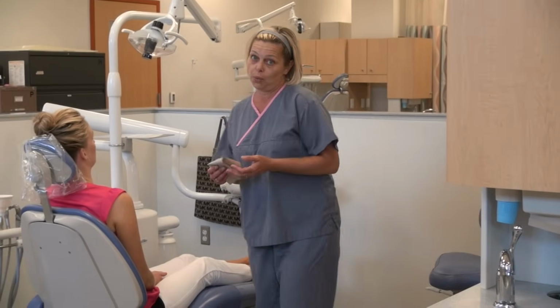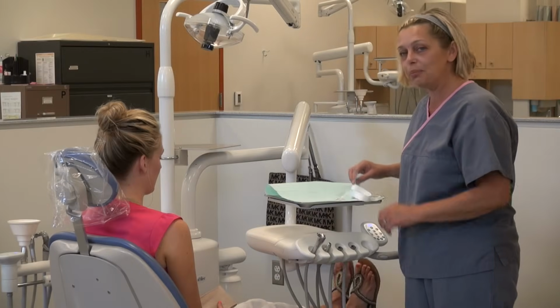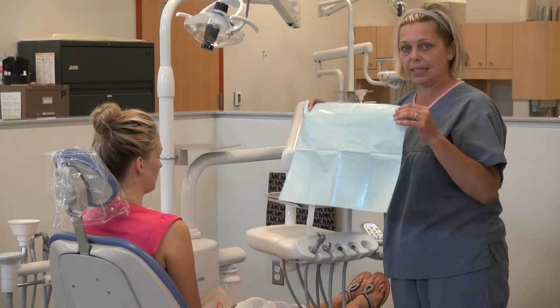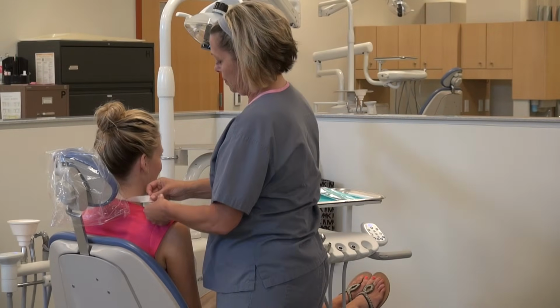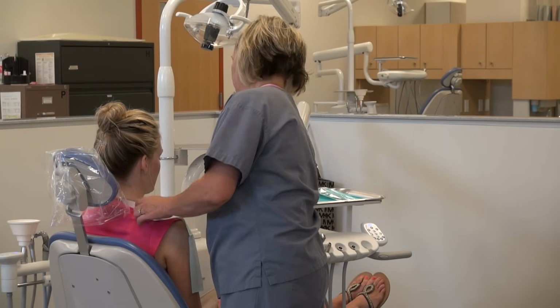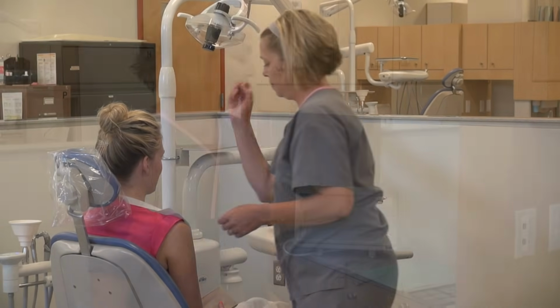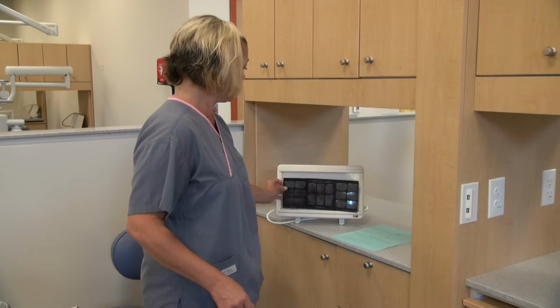At this point, I'm going to offer my patient a napkin, if they're a woman, to remove any lipstick. You don't have any on. You will then place the patient napkin with the plastic side facing them. Review the patient's medical dental history and ask them if they have any questions about today's procedure. And then we're going to place any x-rays on the view box.